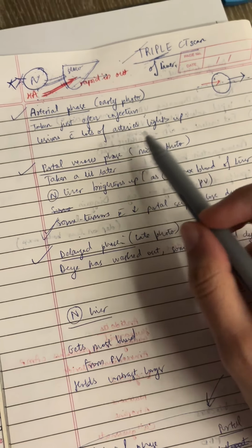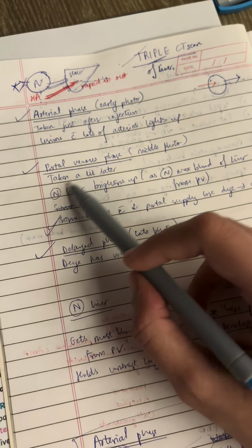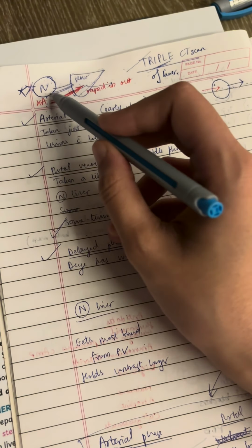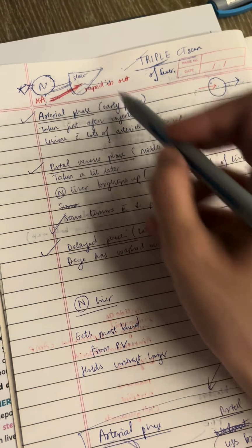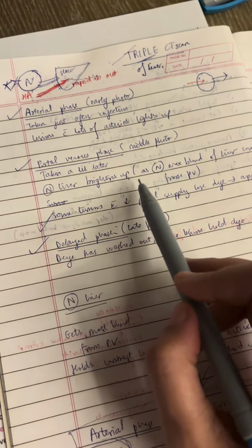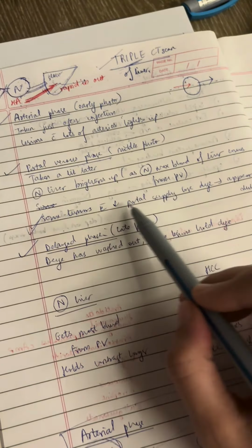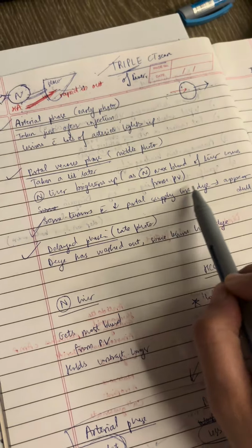The second photo that we take, the middle photo, is the portal venous phase. It's taken a little later, and in this, the normal liver brightens up. Remember I told you the portal vein has slow, gradual blood supply. So it'll brighten a little later than the arterial phase. Normal liver will completely brighten up since it's the majority blood supply, remember? But some tumors with decreased portal supply will lose the dye here.